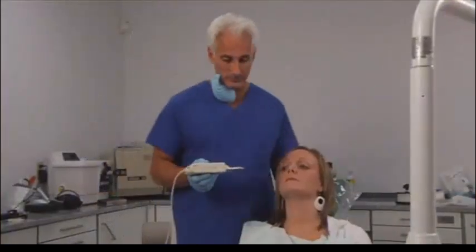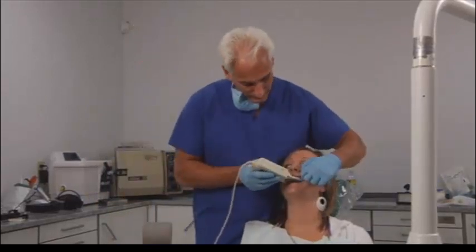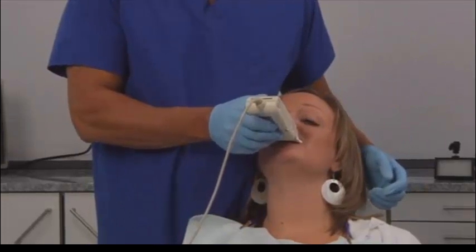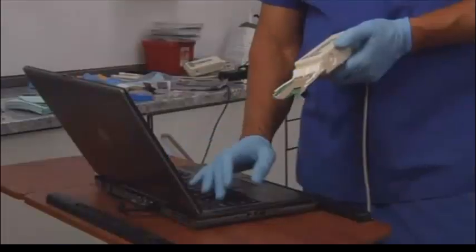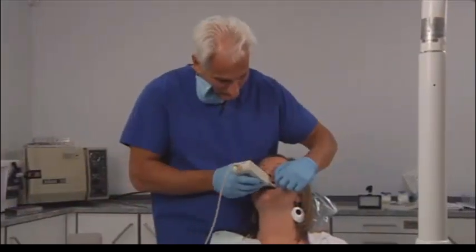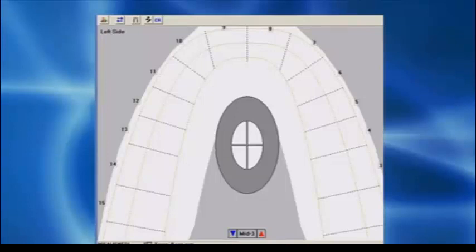Okay, Carolyn, we're going to re-record now going right, left, and forward. Okay, put your head back. This will be to the right. Go ahead and bite down again. There we go. Open, bite down again. Now go to the right. Good. Excellent. Okay, this time you're going to go to the left. Go ahead and bite down. Good. Open. Bite down again. Stay there. Now go left. Good.